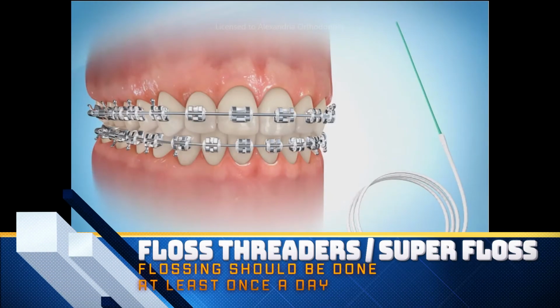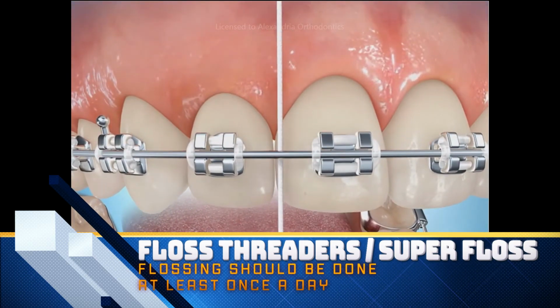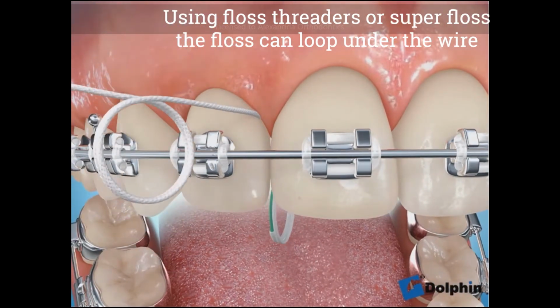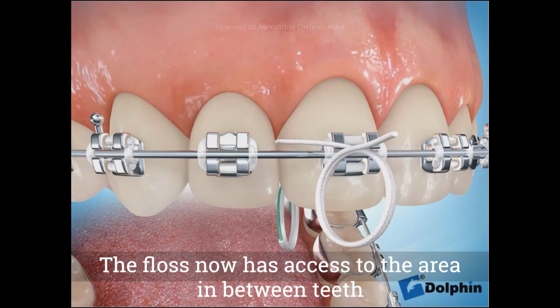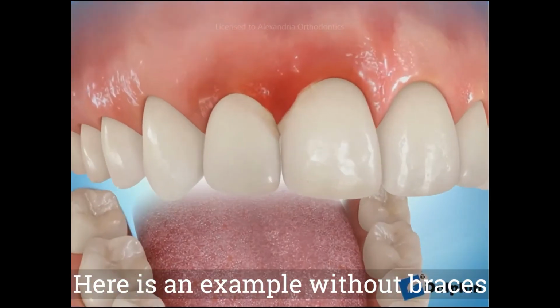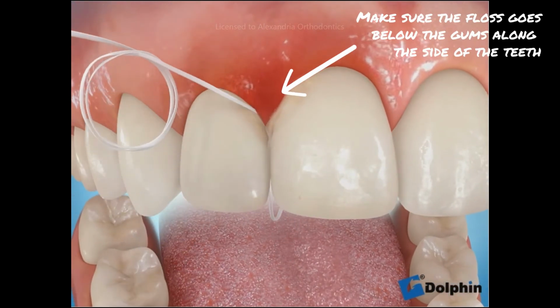Floss threaders or super floss are also included in your cleaning kit. Often these flossers have a plastic point that allows you to thread the floss under the wire to floss in between the teeth. Make sure you take the floss slightly beyond the gum line on each side of each tooth. Flossing may seem time-consuming, but with some practice, flossing should not require more than 2 minutes. Plan to floss at least once a day for proper oral hygiene.